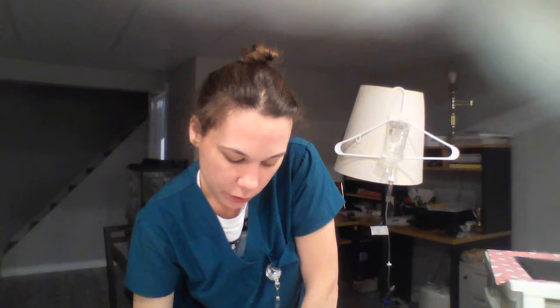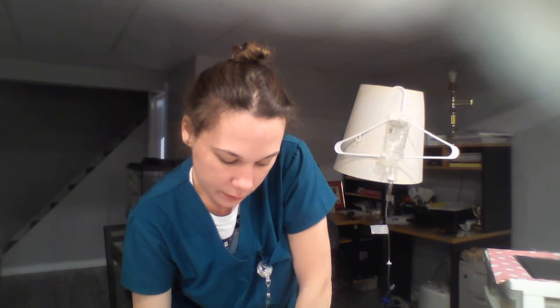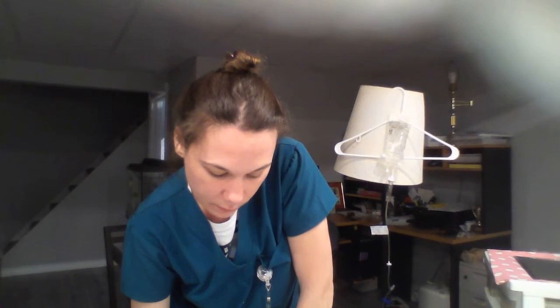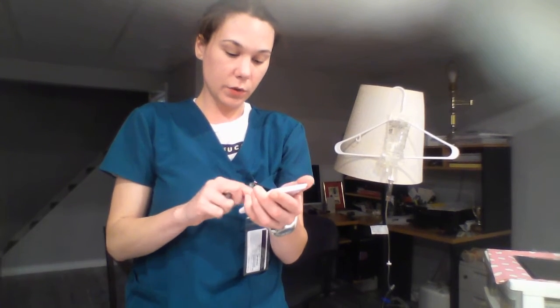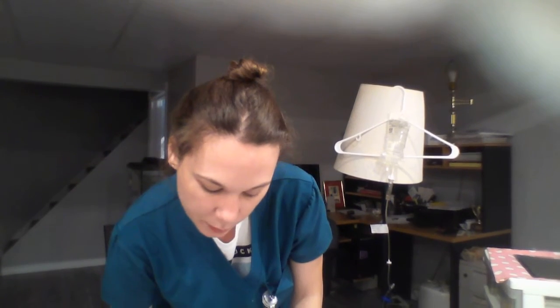So my volume is going to be 50 milliliters. My time is 20 minutes times 10 milliliters. So 50 divided by 20 times 10, 25 drops per minute.